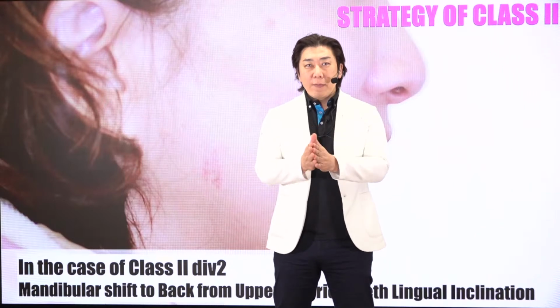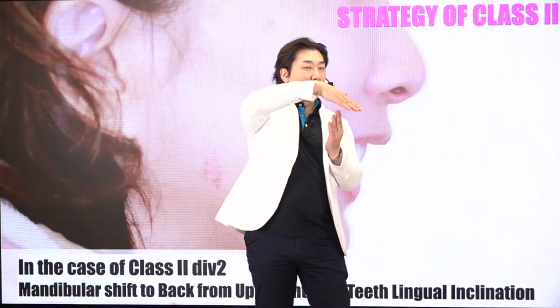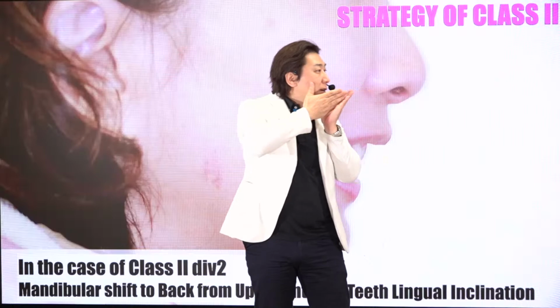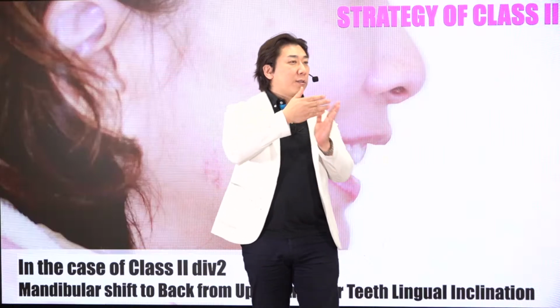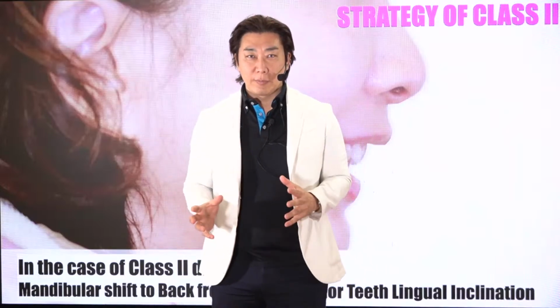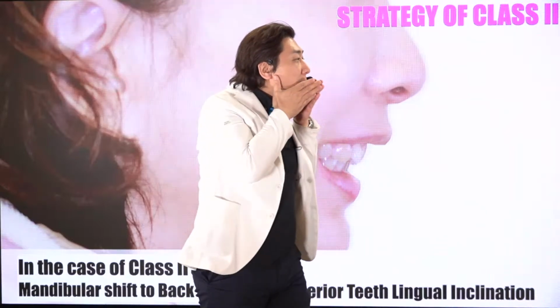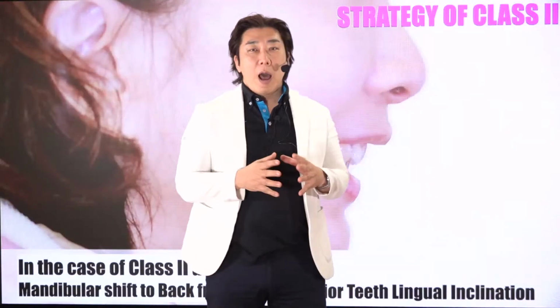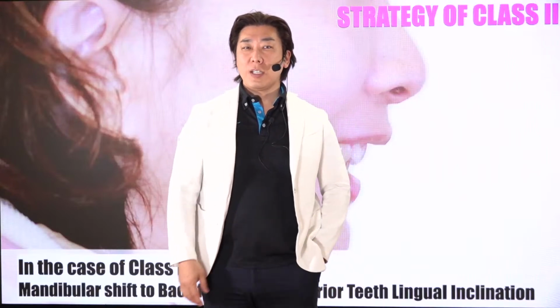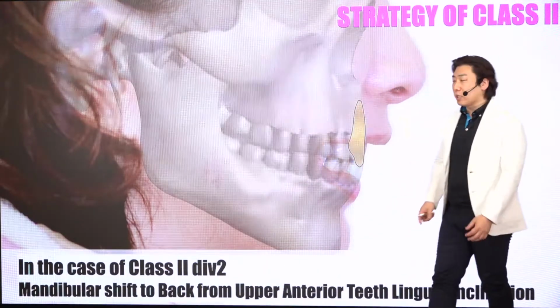If it is a class 2 division 1 patient with a severe bulge like this, there is no need to think about the mandible shifting to the back, right? But with class 2 division 2, we have to think about the position of the mandible. In class 2 division 2 like this, the patient's mandible shifts to the back. How can we start from this position? Is it right or not? Very important thing, the initial position.